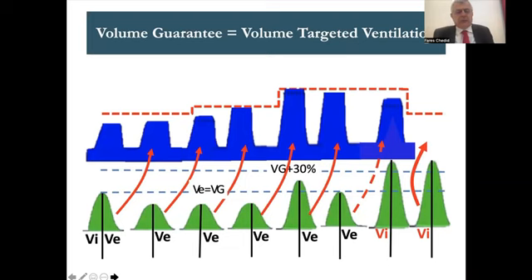What is volume guarantee? Like always, it's a pressure control mode where the pressure that we subject the ventilator or the patient to creates the volume. But now that the volume is created, the expiratory volume of each breath will order the PIP of the next breath. So we have a target volume, the VG, volume guarantee. In some ventilators, we call it volume targeted ventilation. So we compare the volume expired to the target volume. If the expired volume is equal to the target, then the next pressure will be the same as the previous one.